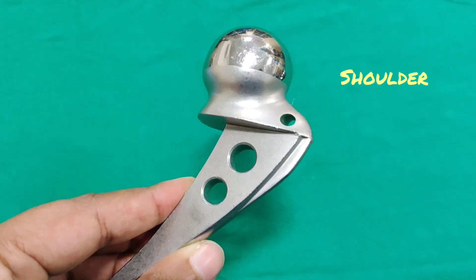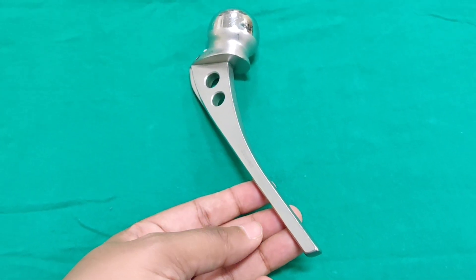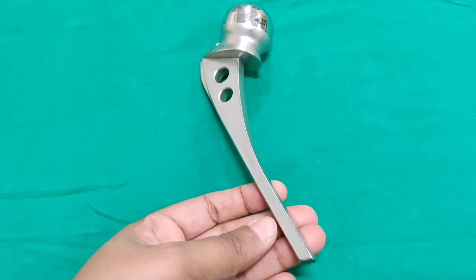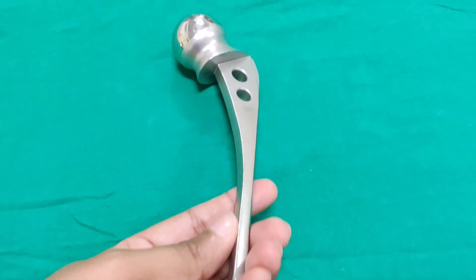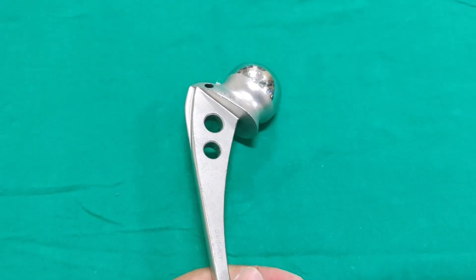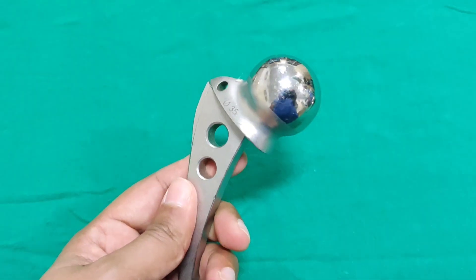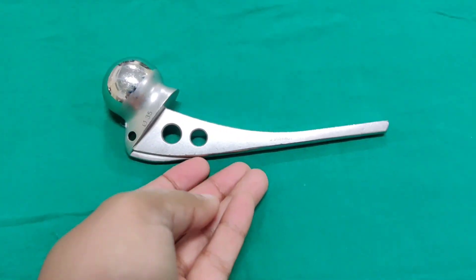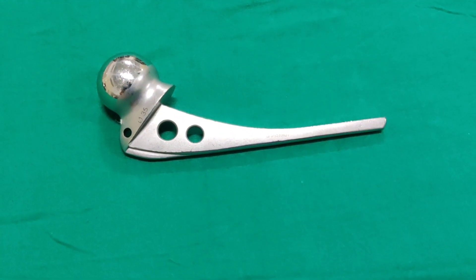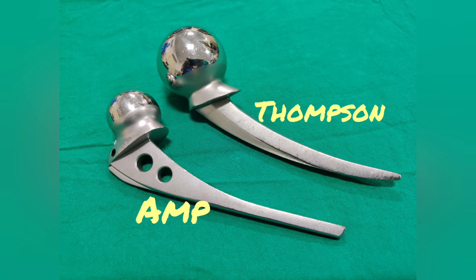The shoulder region of this prosthesis fits into the greater trochanteric area and prevents rotation. The indication for this prosthesis is when adequate calcar is present — at least 1.5 cm — and the collar sits into the calcar portion of the femur. It is also a unipolar prosthesis like the Thomson prosthesis, and the main differentiating feature is that it has holes in the stem.